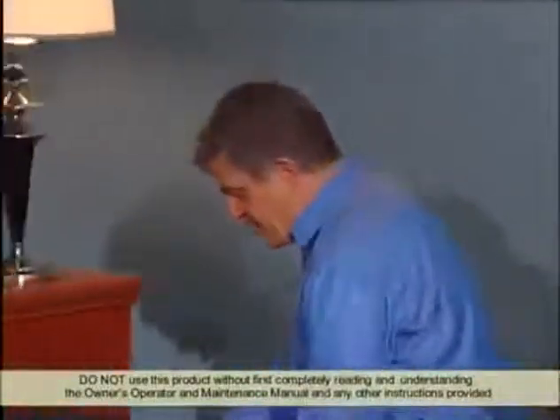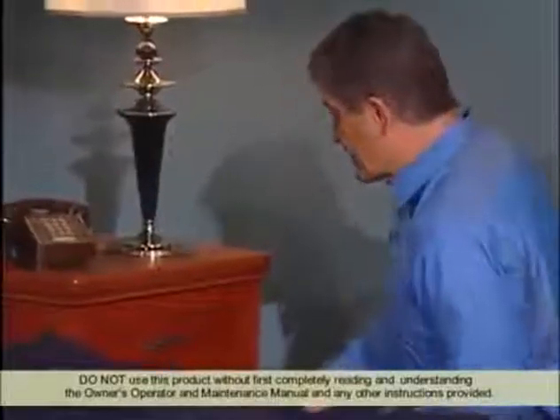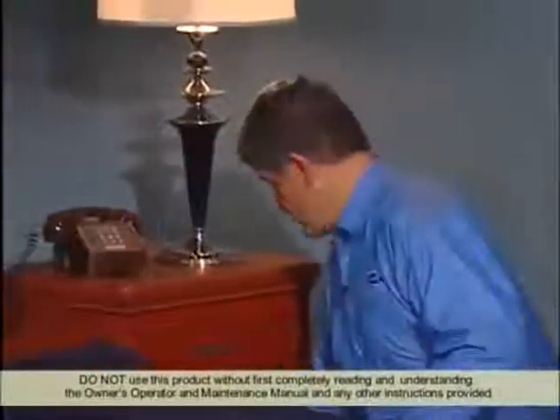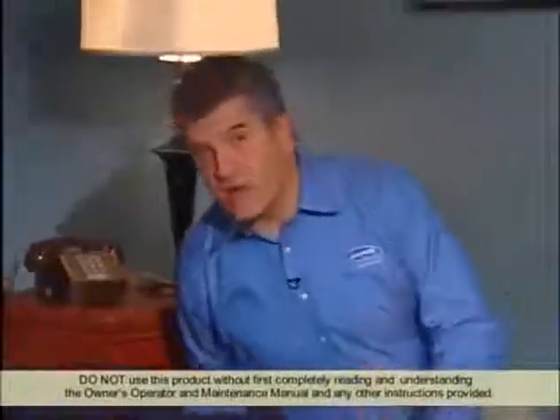Avoid creating a trip point when you're setting the power cord. Make sure it's routed in a way that's not a hazard to anyone walking through the room. Also make sure that it's not entangled in any of the moving parts of the bed itself.